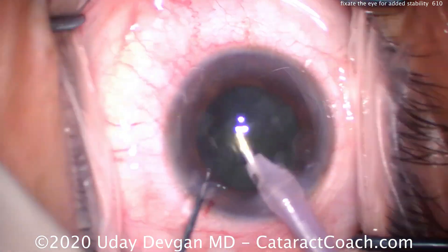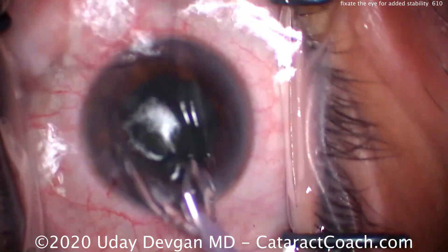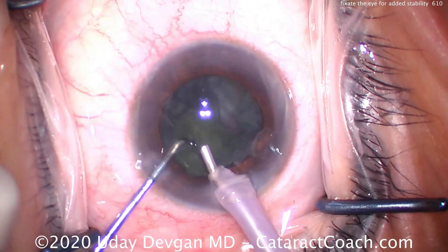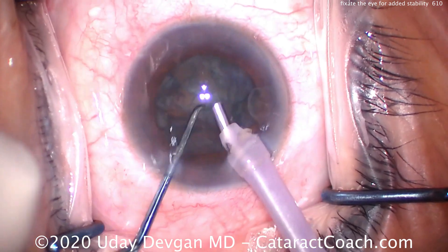Now this patient's going to be — oh, look at that! Did you see what happened? So this patient's not going to be totally cooperative. The patient just woke up, dozed off for a little bit, woke up, got startled and moved — and you saw nothing untoward happened.